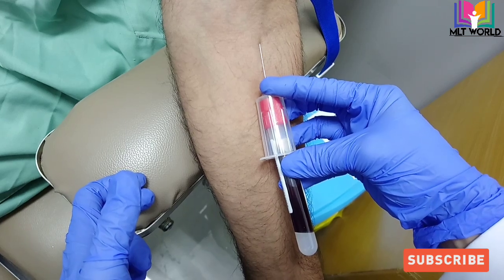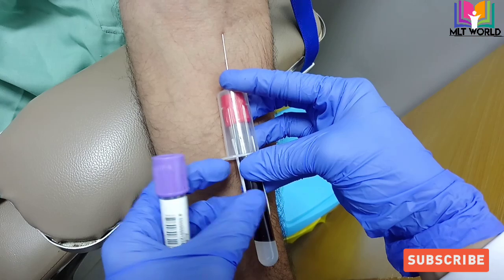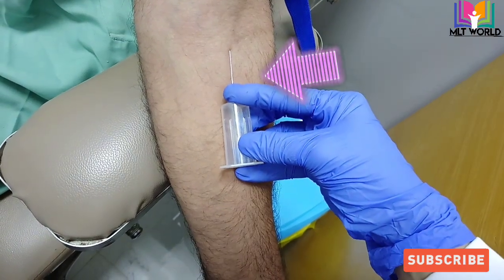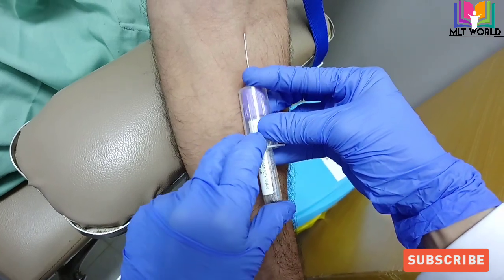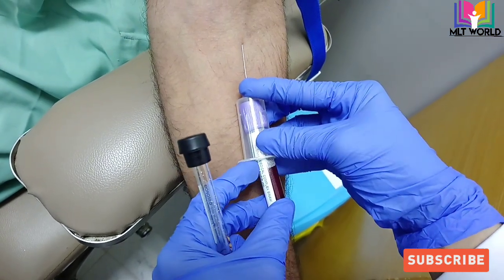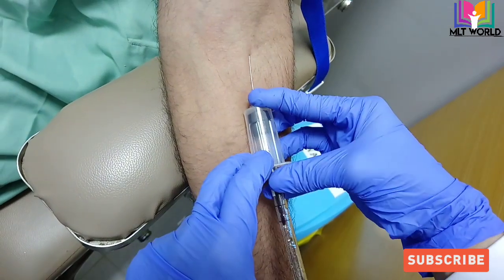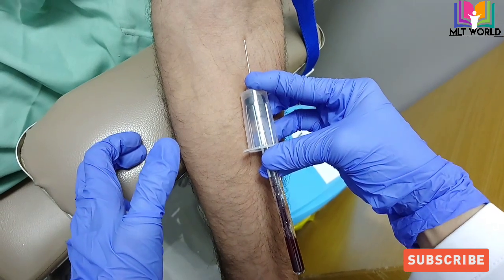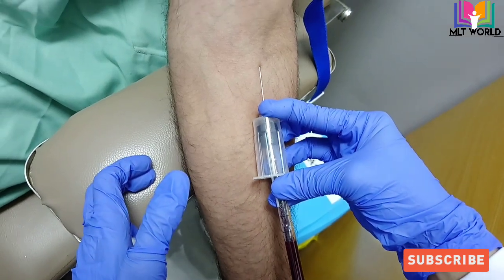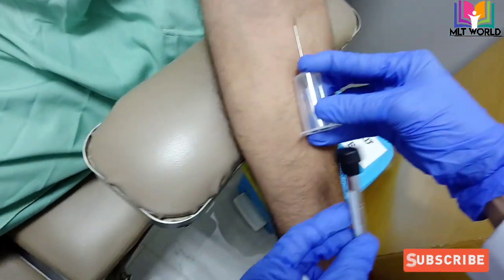One common mistake is that when inserting the sample tube, we lose focus on maintaining pressure and the needle comes out. When you insert the sample tube, maintain your pressure; when you remove it, it is easy. Then keep your pressure maintained and insert the second tube. Due to the vacuum in the tubes, blood will come automatically, and when the vacuum is finished, blood will stop — at that point you can withdraw the tube.